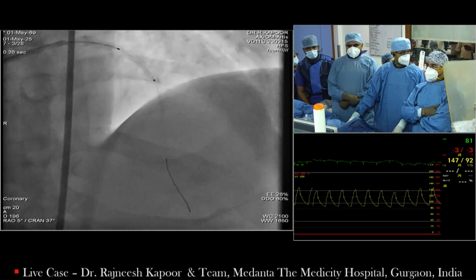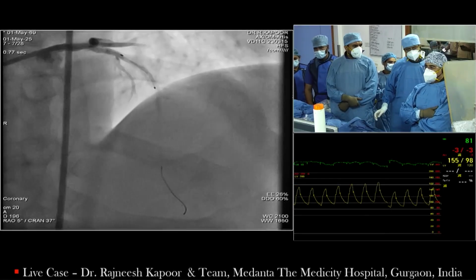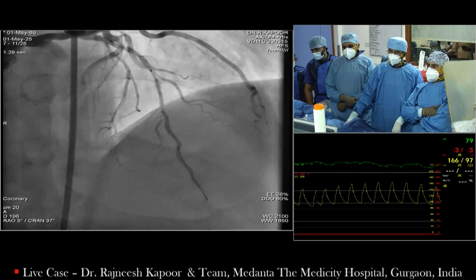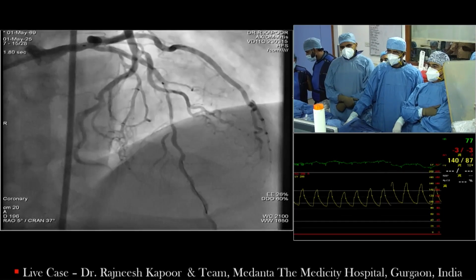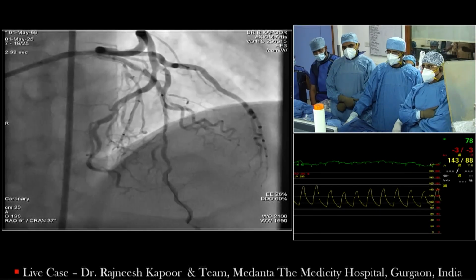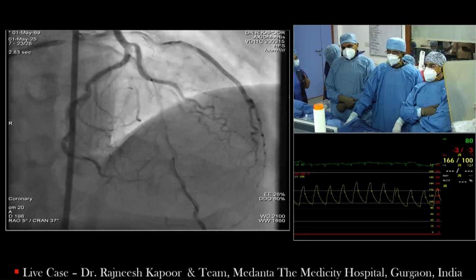Bashir, what is the left ventricular function in this patient? Because the length of the ablation that you will have to do is very long. So the chances that you're going to have a no-reflow, it is important. So what is the left ventricular function, to see whether I would have considered additional support? So LV function is normal.